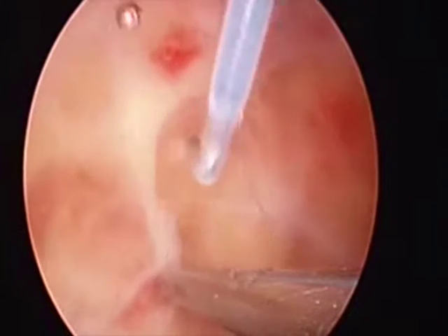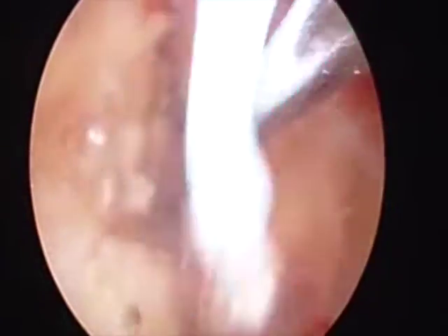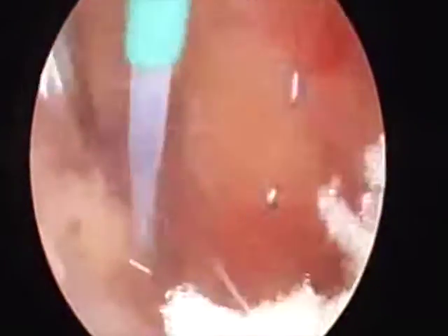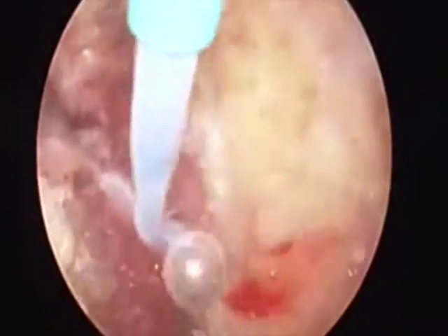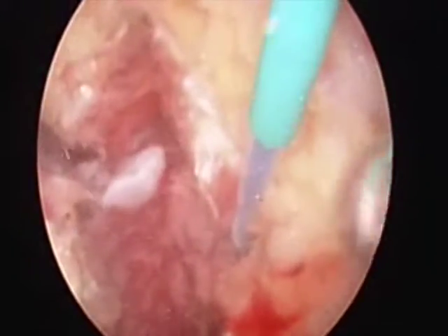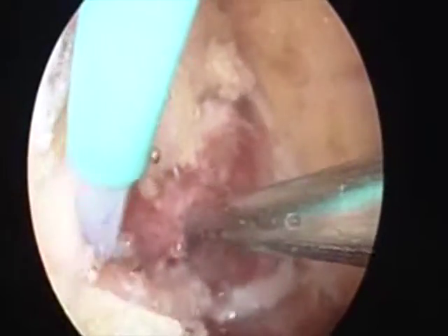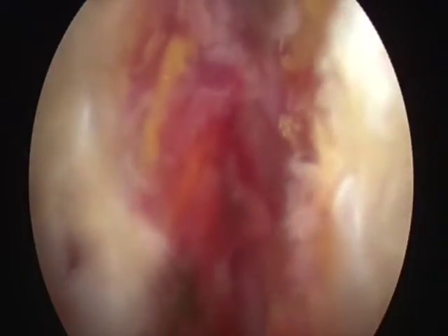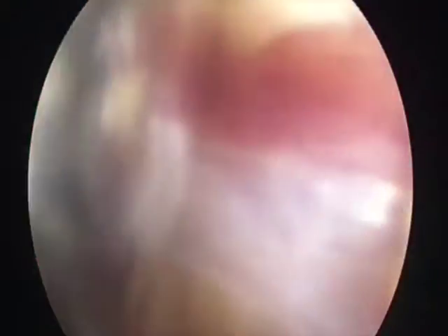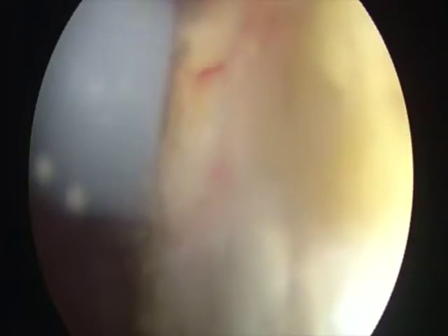The spinal needle is identified endoscopically lateral to the iliotibial band. Using a radiofrequency hook probe, incisions are created proximal and distal to the spinal needle on the iliotibial band. Anterior and posterior incisions are also created at the mid portion of the longitudinal cut.